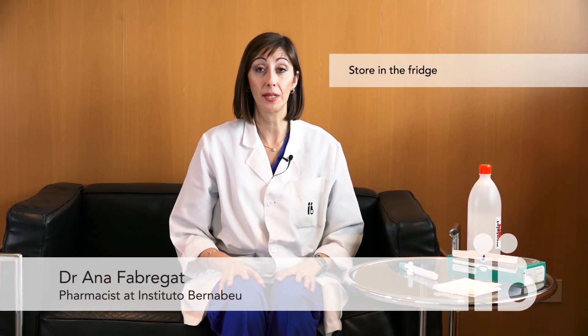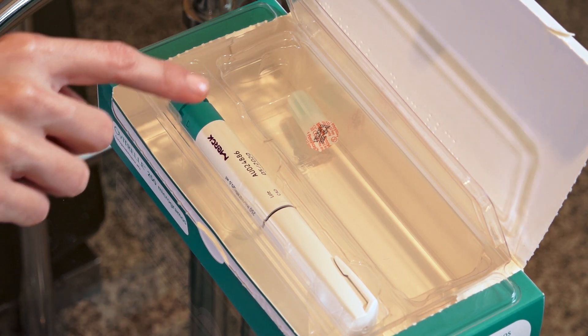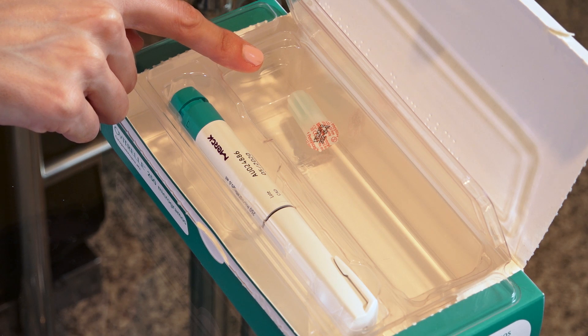Ovitreal must be stored in the fridge until required. It must be brought up to room temperature five to ten minutes before it is injected. On opening the box, you will find a pre-charged syringe containing the medicine, plus a needle wrapped in plastic.